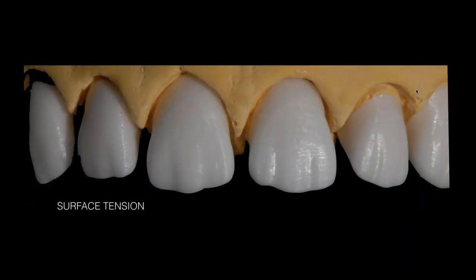The other thing I want you all to be clear of with the zirconia materials that we use today: there's always a big debate on surface tension and do we sandblast or do we not sandblast. I'm going to go against some of the manufacturers and tell you that I always lightly sandblast my zirconia. And I think that's a really important part of the process. I do understand that it could have some detrimental issues, and I'll explain to you how I deal with that. But in the end, what I don't want to happen is I don't want to create a surface on the zirconia that rejects the other materials. I want to make sure I'm breaking the surface tension.